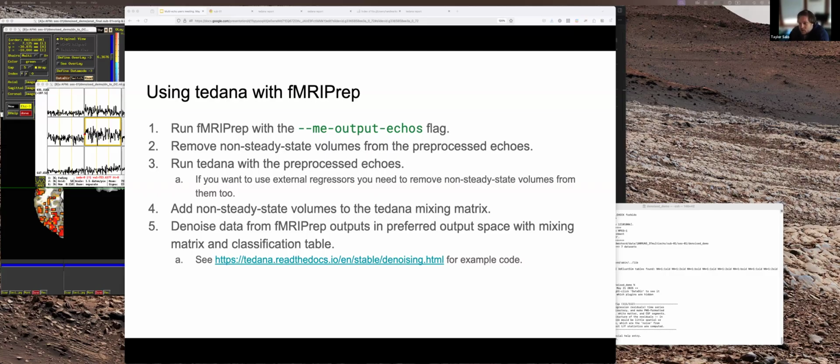I think including motion regressors as external regressors is probably better than including them as additional confounds, like Dan did in his example. I think that's a really great way to do it. I'll add to that one on the motion stuff. My ideal is we have 12 motion regressors usually, and some people do even more, and that results in a lot of loss of degrees of freedom.